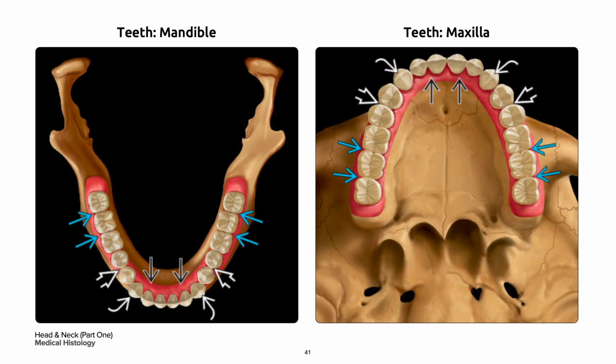On your left is the tooth. Macroscopically, it has a crown and a root, and microscopically, it has enamel, dentin, pulp, the periodontal ligament, and the cementum. There are considerations and variations in your teeth, pitfalls and artifacts. Teeth need to be decalcified for routine H&E slides. The mature enamel is lost because of processing. Often the teeth that are submitted are surgically sectioned, losing normal anatomy and histology. Dental restorations may alter or replace your normal histology.